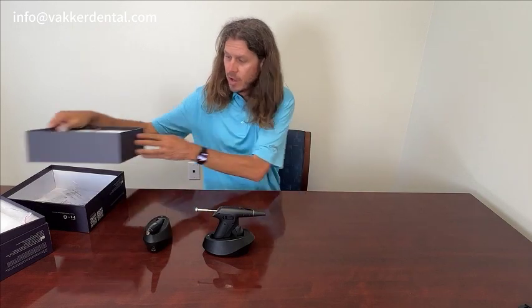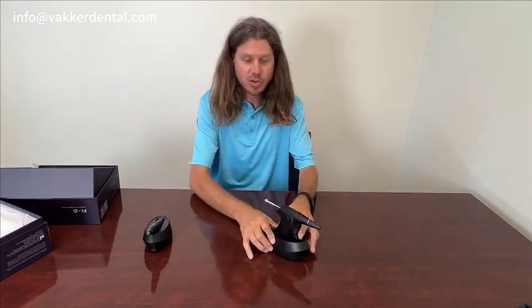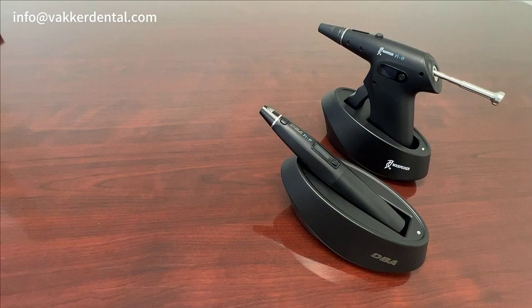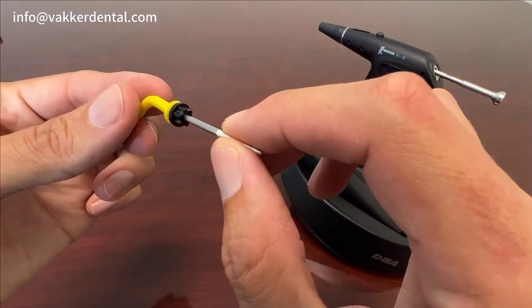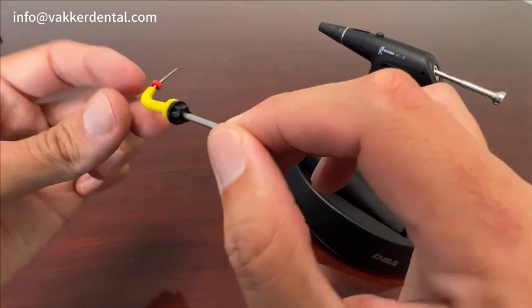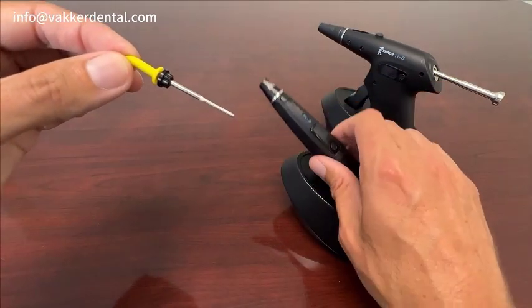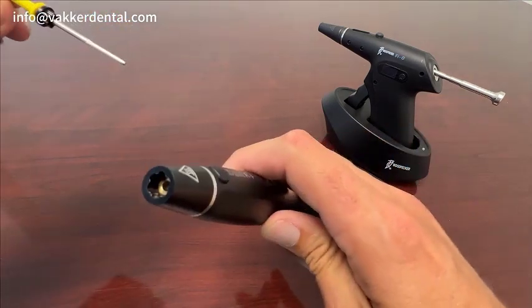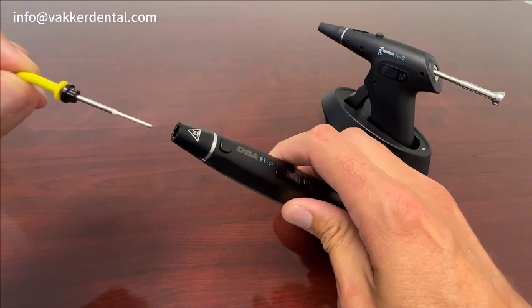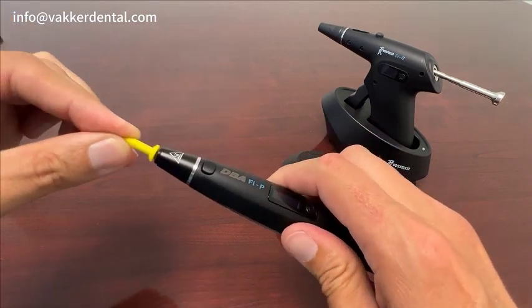Let's dive in a little bit and show you the features and how to operate them. Let's focus in on the obturation pen and gun. First, grab one of the tips for the pen — you'll notice it has some little teeth marks right in there. That allows you to adjust the angle of the tip in the pen, so you're able to adjust it depending on where you want it set.